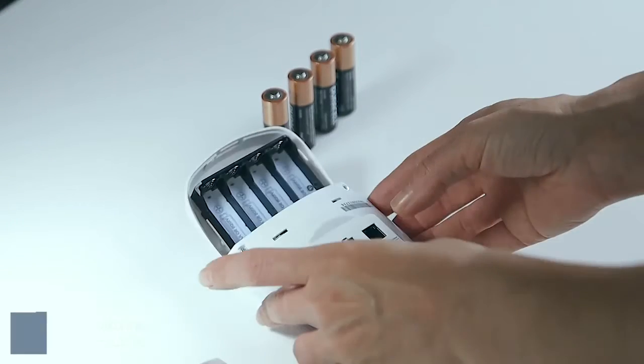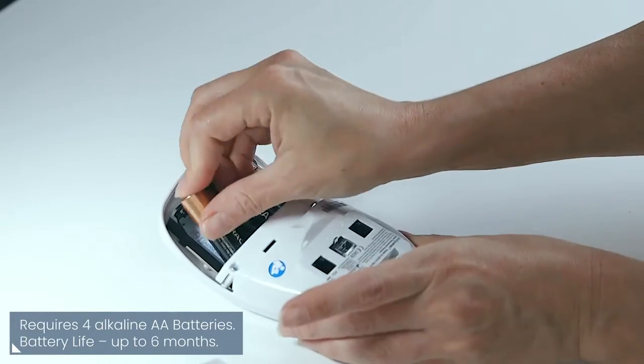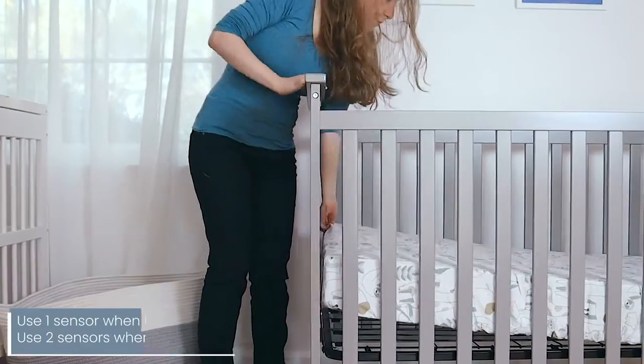The installation is super easy and hassle free. The control unit is operated with four standard AA batteries and has a long battery life, so no electricity is required.